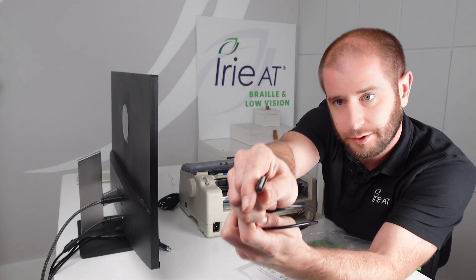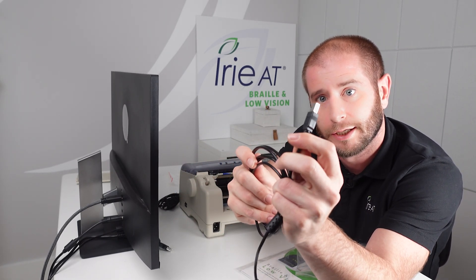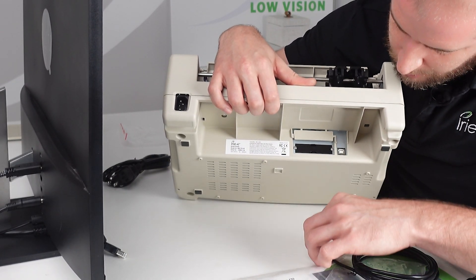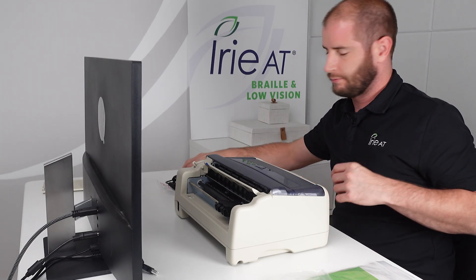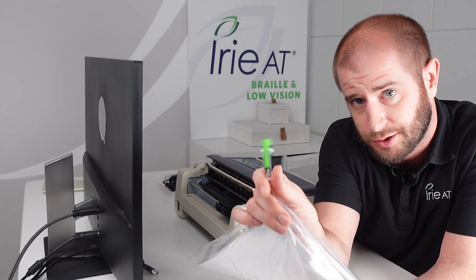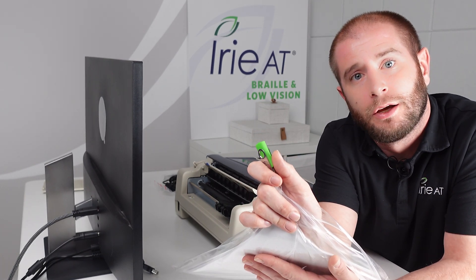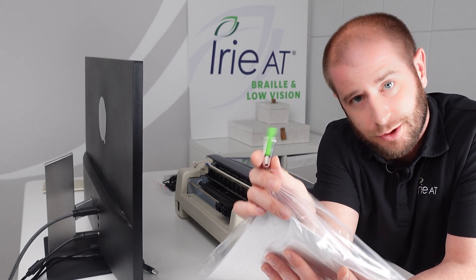The other cable that it comes with is to connect it to your PC — that's going to be your USB cable. You have the one end that plugs into your computer, traditional USB, and you also have the printer USB end, which plugs into the back of the BrailleBuddy. That spot is a little different — it's underneath, on the right-hand side if you have the back facing you. The USB stick also has your documentation as well as the software install files. The BrailleBuddy comes included with the Tiger Software Suite — Braille translation and tactile graphics software — which you'll also find on the USB stick.